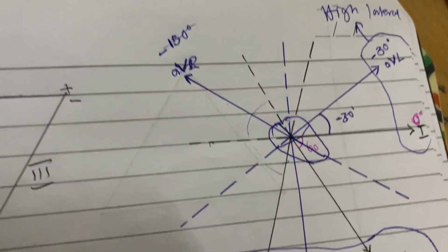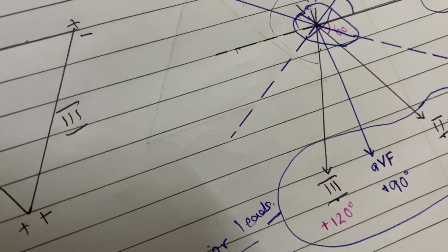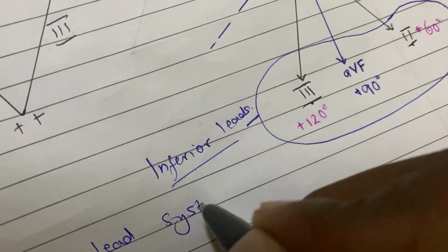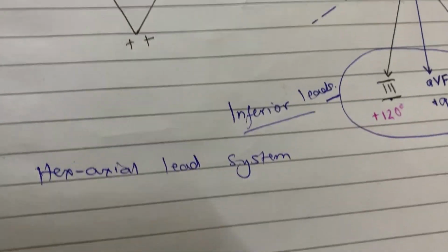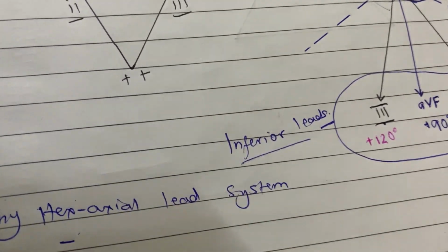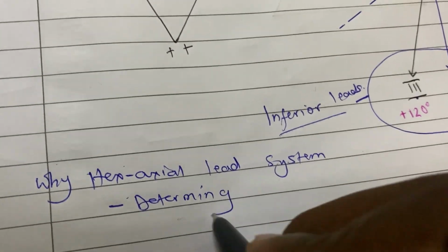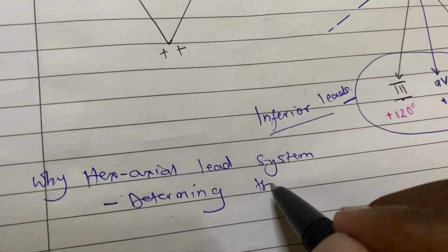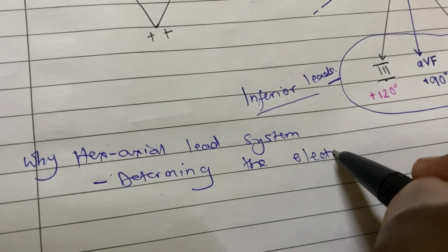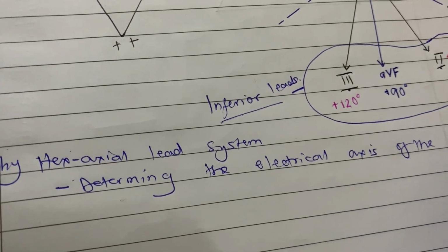Why is it important? It is important for determining the electrical axis of the heart.